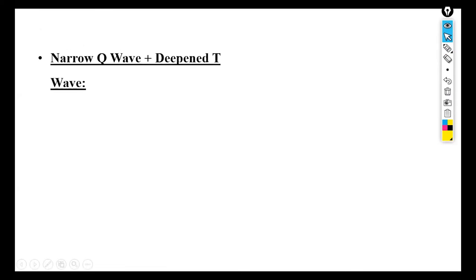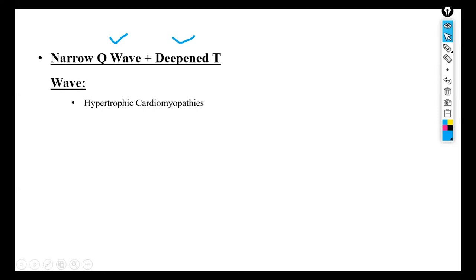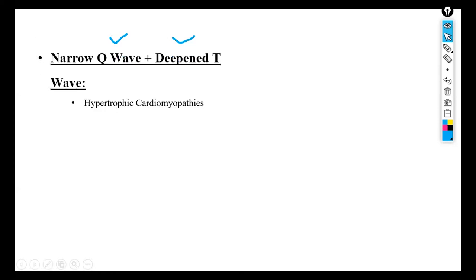The next ECG finding is narrow Q wave plus deepened T wave. This generally occurs because of hypertrophic cardiomyopathies — whenever there is hypertrophy, i.e., enlargement of the heart with associated cardiomyopathies, we see a narrow Q wave combined with a deepened T wave.